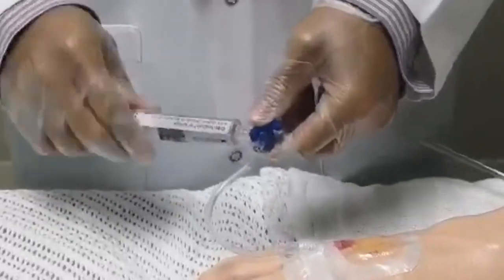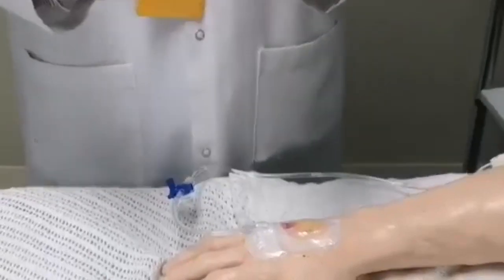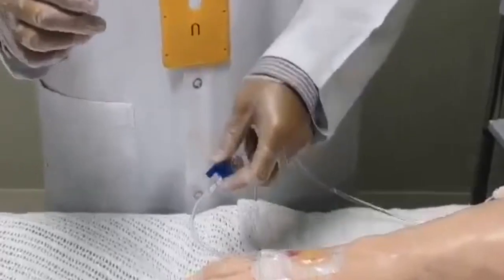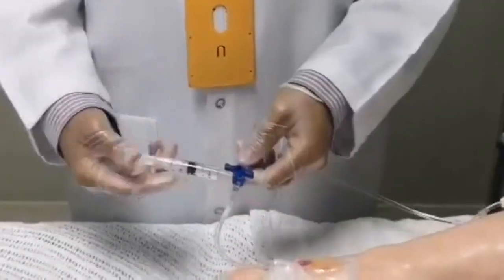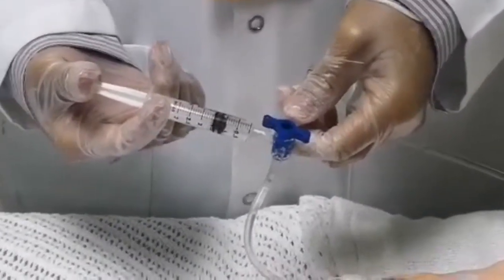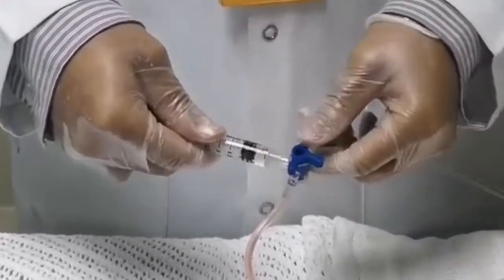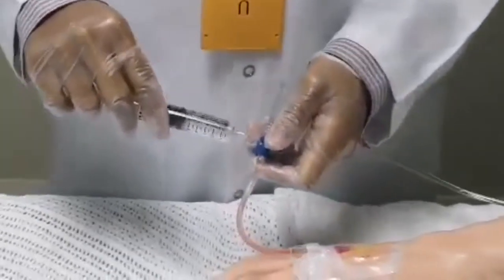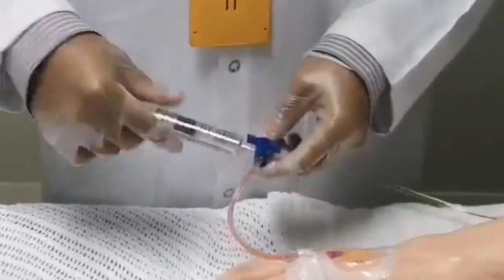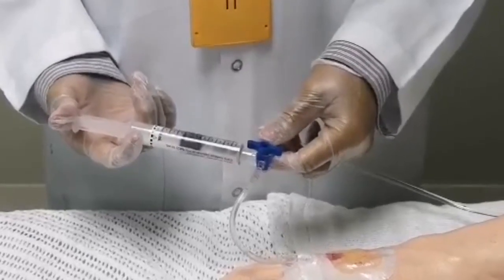Close the three-way saline lock. Remove the needle from the prepared syringe containing the medication and attach it on the IV injection port. Open the three-way saline lock and push the IV medication at a prescribed rate. Close the saline lock and remove the used syringe and discard. Reconnect the flushing syringe and flush the line three to five ml. The goal of the second flushing is to push the medication towards the patient's vein.